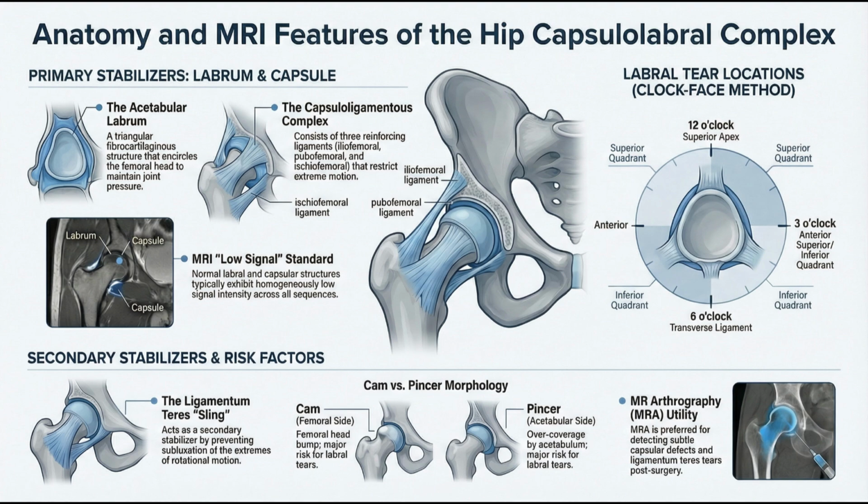And here's the scary statistic. Up to 25% of perfectly healthy people have these grooves. So let's play that out for a second. You could go into an MRI machine because your hip hurts. The radiologist sees a gap in the labrum, calls it a tear, and you end up getting surgery you didn't even need. That has happened, absolutely. That is exactly why this paper is so emphatic about distinguishing the two. You have to play detective and look closely at the edges.